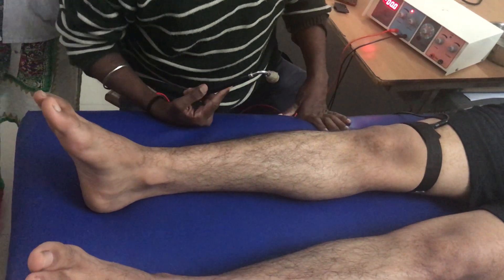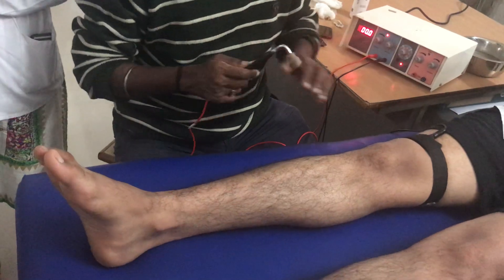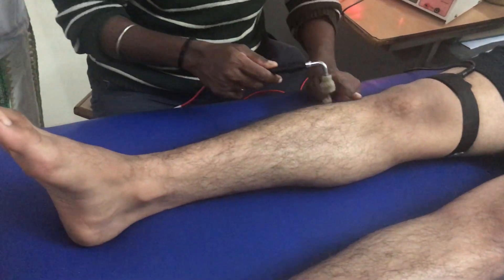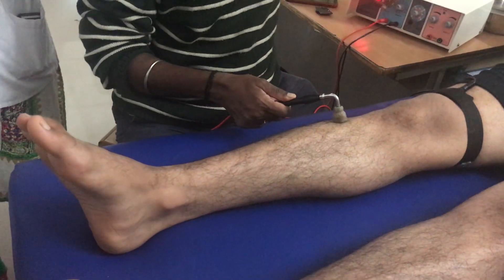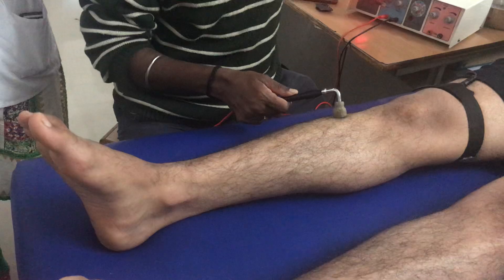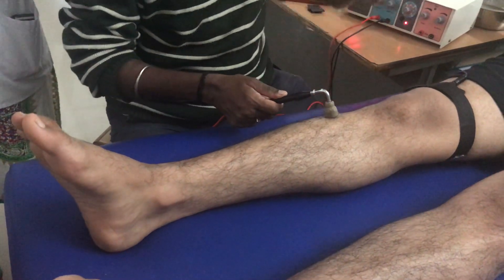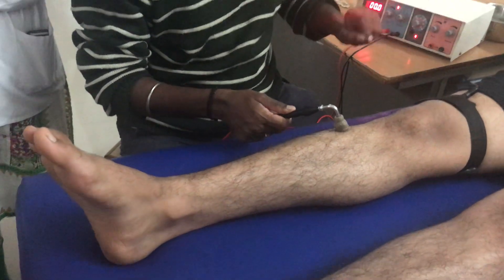The longest available duration in this simulator is 300ms, and I am choosing this. I am going to place my electrode over the motor point, which I actually mark. Now, for a beginner, it is okay to mark the motor point.